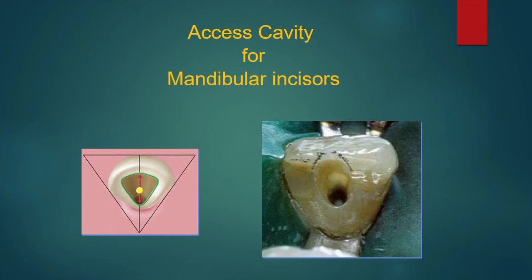Now, sometimes when we have limited access, this will impede the instrument from getting into the lingual canal. So, removal of the coronal obstacle is required to have an adequate access cavity so the file can enter the lingual canal easily.